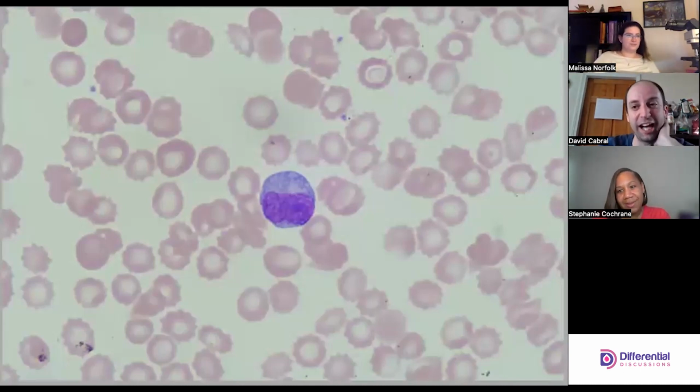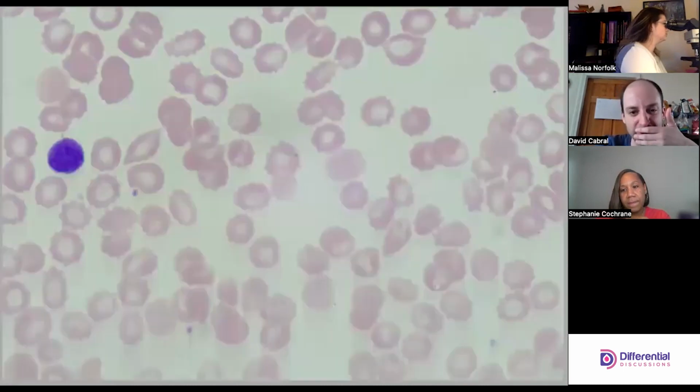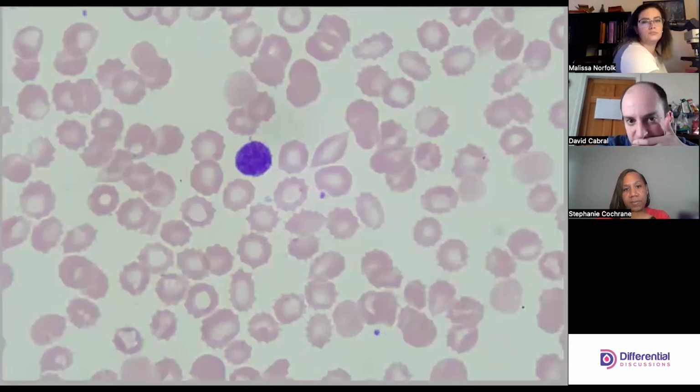I'm very puzzled. I do see some, I think we're seeing reactive stuff though, right? I don't think I'm terribly worried about leukemias. I think there might be some kind of an infection. And there is almost no cytoplasm in that cell. Right. Troubling. Size-wise, still looks mature. I'm thinking like 7-day-old. I really don't like this lack of cytoplasm.